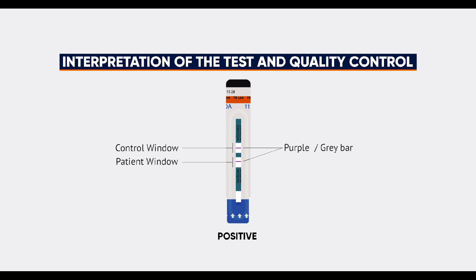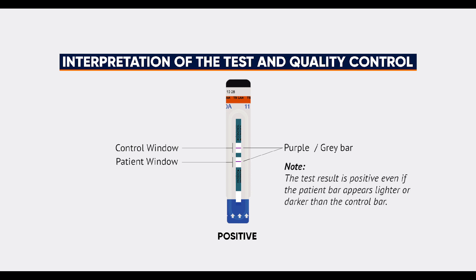The appearance of two purple or grey bars in both the control window, labelled 'control', and the patient window, labelled 'patient', indicates the TB-LAM result is positive. Note that the test result is positive even if the patient bar appears lighter or darker than the control bar.